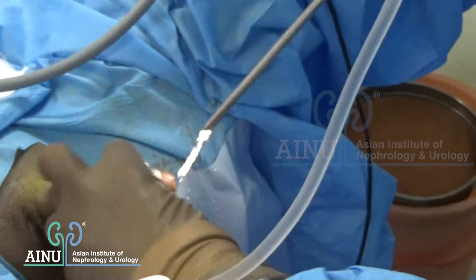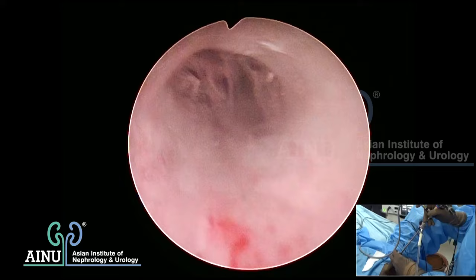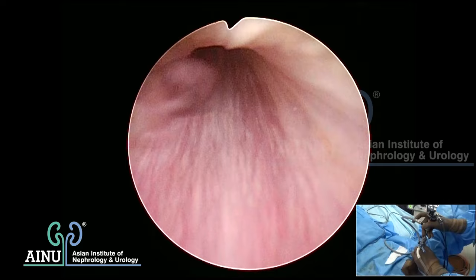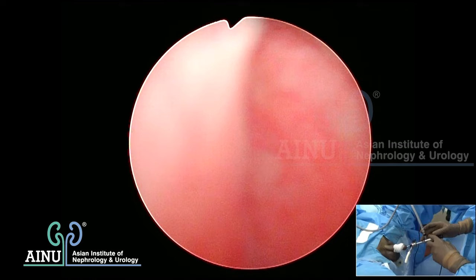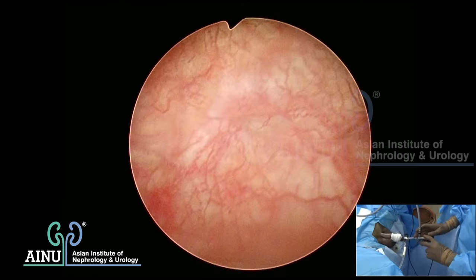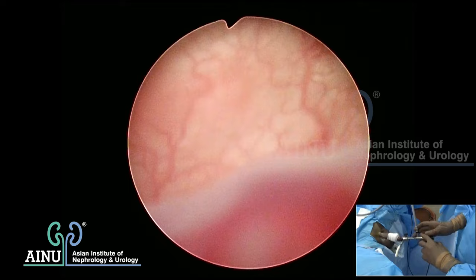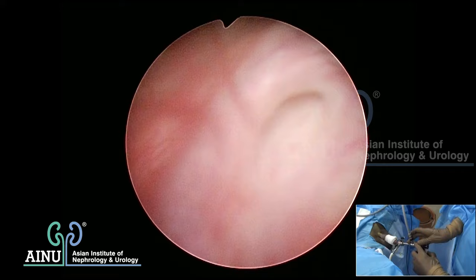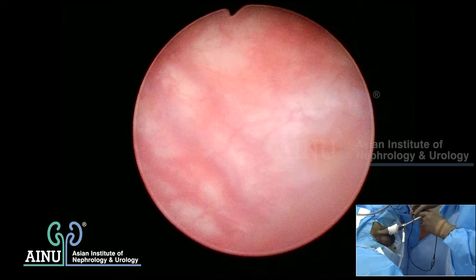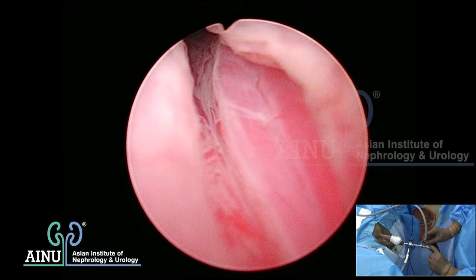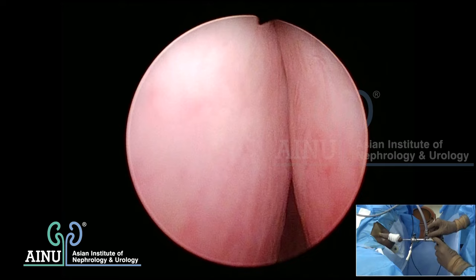Cystoscopy is being done. That's a normal penoscrotol junction, bulb, and that's a verumontanum. There's a large median lobe blocking - you suddenly enter a cavity and cannot see clearly. The ureteric orifices are visible - that's the left and right ureteric orifice. The median lobe is covering the trigone significantly. There are two lateral lobes touching in the middle with a little overlap.